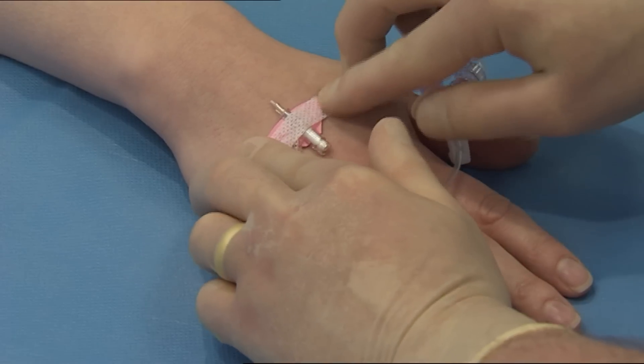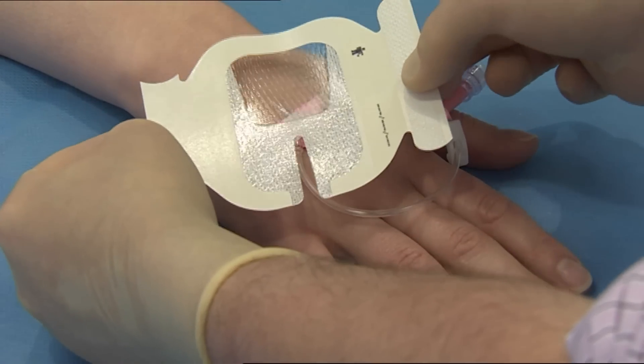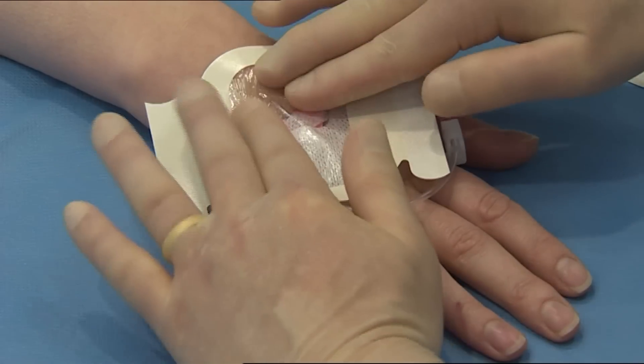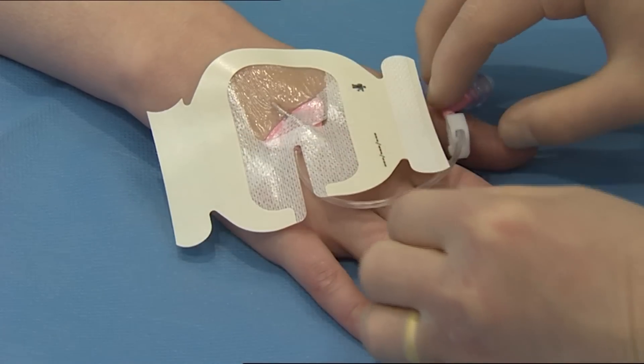Peel the paper liner from the paper framed dressing, exposing the adhesive surface. Using the dressing handles and incorporating a non-touch technique, place the dressing over the catheter so that the transparent film is over the insertion site and the notch of the dressing is in line with the extension tube.